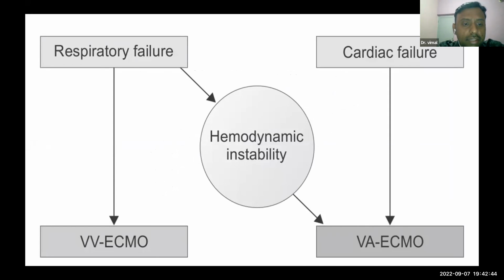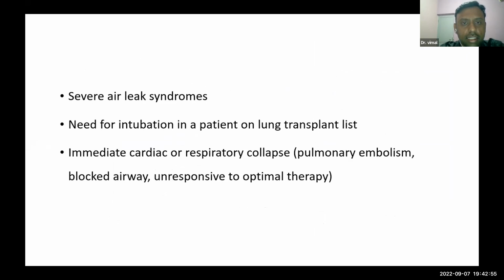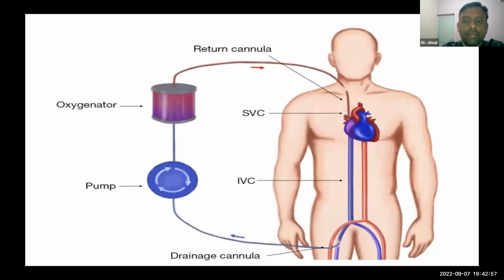We will be dealing with VV ECMO in this session. So VV ECMOs are used once there is a respiratory failure. Just to have a better understanding, I will show you one of the figures over here. So it's nothing but the veno-venous ECMO.